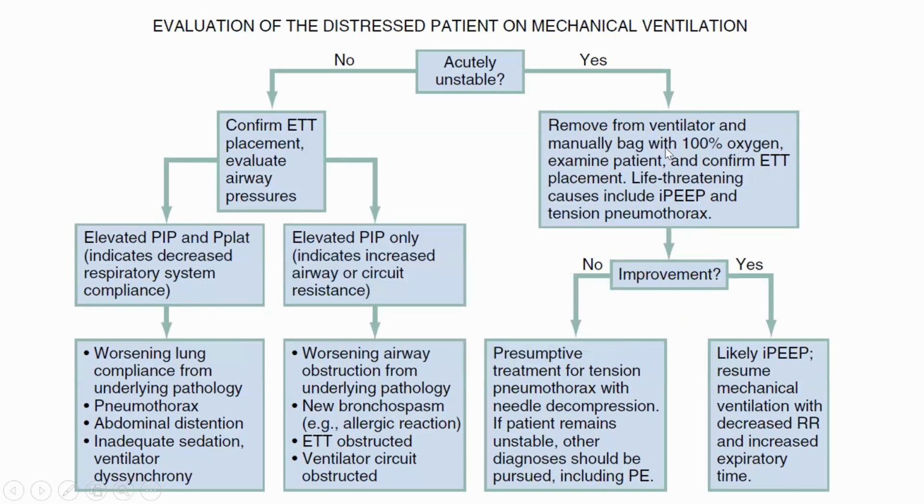If you are facing a very significant resistance while bagging the patient, it could be obstruction, so you need to suction out. So if you can pass the catheter, if you can suction, then obstruction is an unlikely cause. So you need to think of pneumothorax. You can do needle decompression. You can also use ultrasound assessment to look for any pneumothorax. But if you suspect pneumothorax, it should be treated right away, before going for ultrasound or imaging. Okay, so you can do needle decompression.